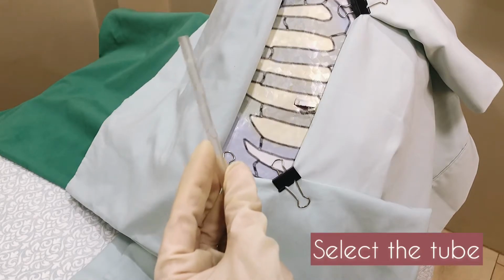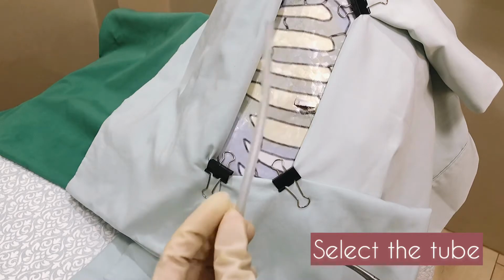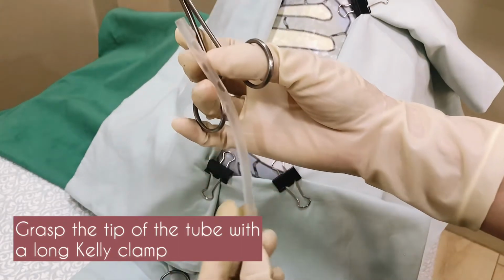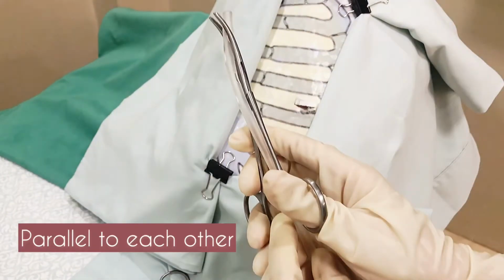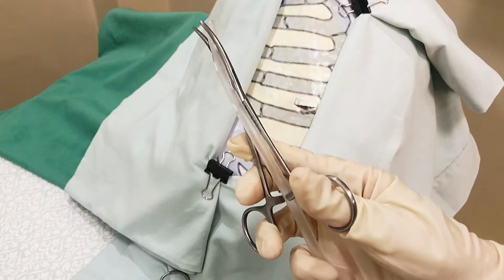Select the tube to be used. Note the location of the holes and the distance of the proximal hole to the tip of the catheter. Grasp the tip of the tube with a long Kelly clamp so that the long axis of the clamp is almost parallel to the long axis of the tube. Measure the distance and note or mark with another smaller clamp.